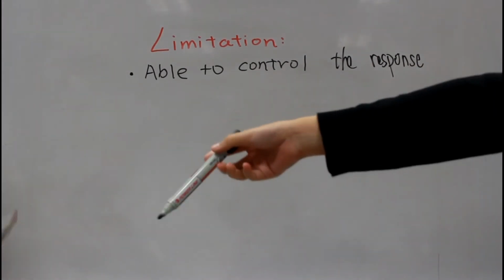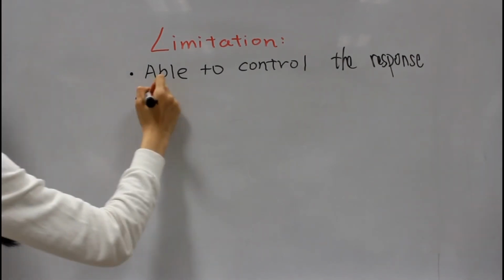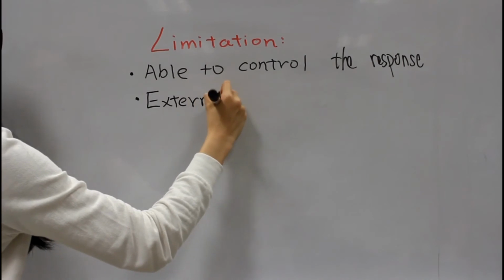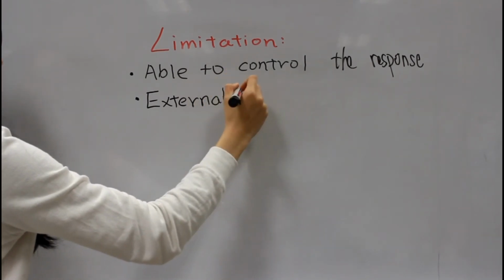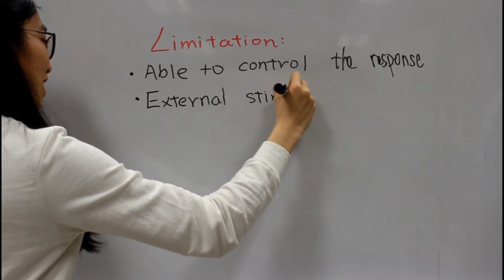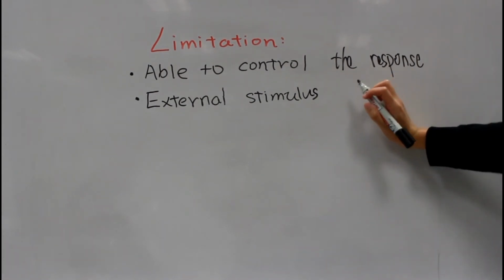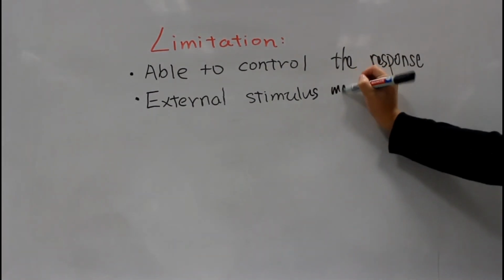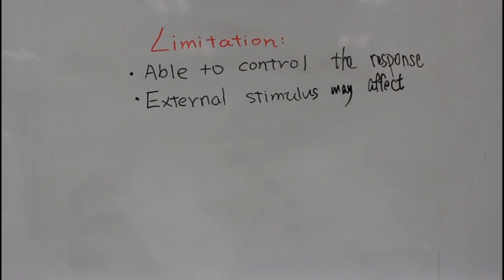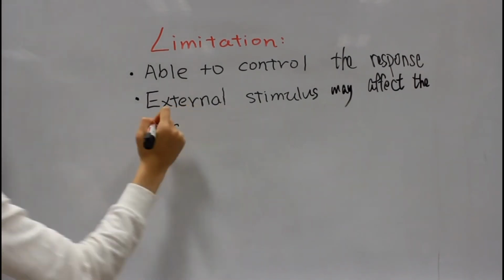External stimuli such as lighting, sound, and color may affect the recording due to emotional change. Also, humidity and temperature will affect the EDA. When the subject feels nervous or is in an environment with higher temperature and humidity, the EDA recording becomes higher.